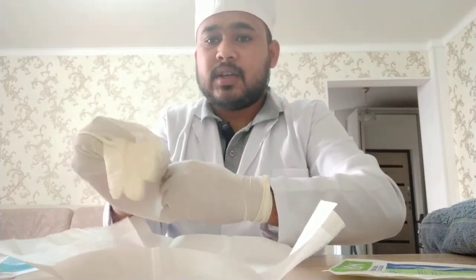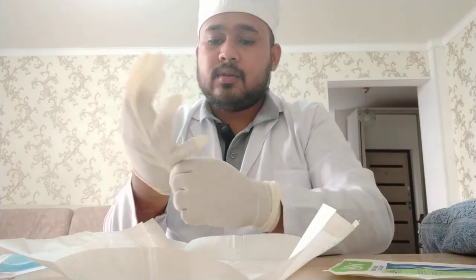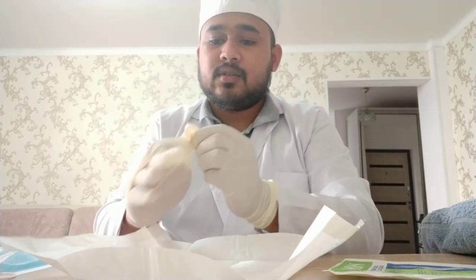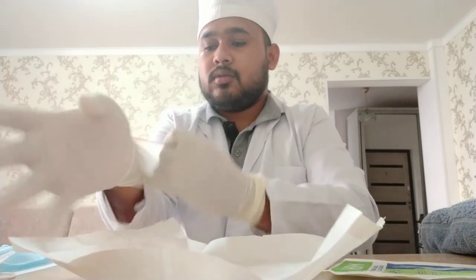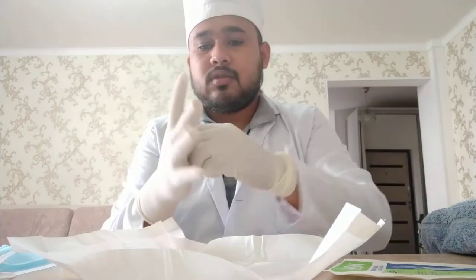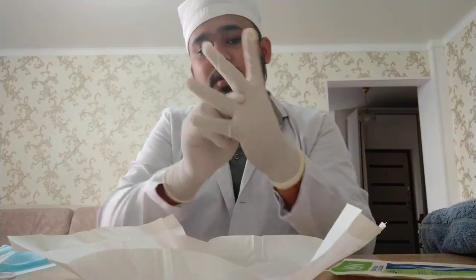Do not touch the sterile part of the gloves with the free hand. So now I just put it on — fit your gloves to your hand. All set.